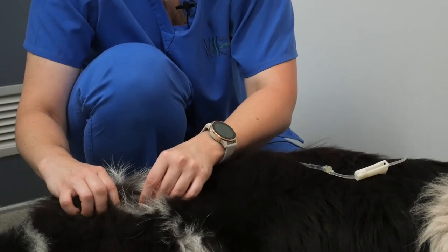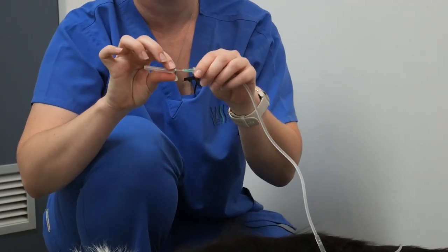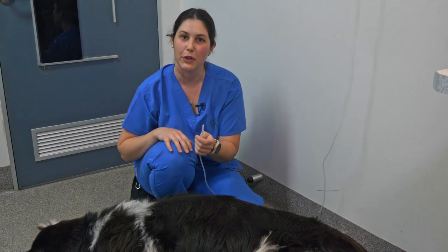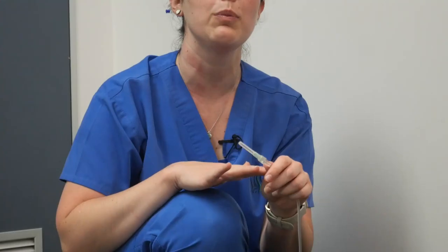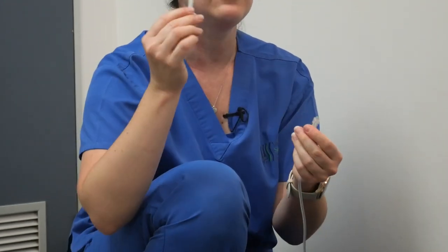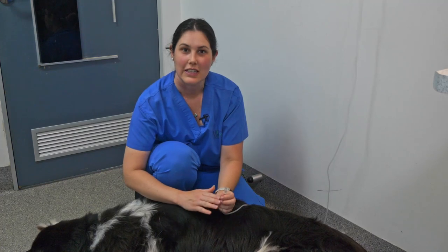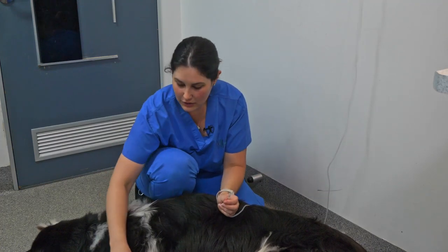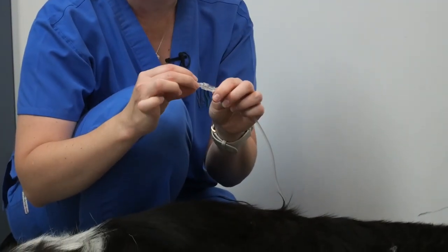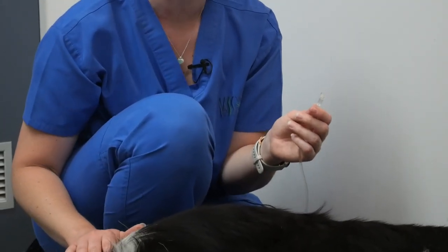Then pull the needle out nice and cleanly, just like that, and replace the cap so it's nice and secure. When you've finished, keep everything clean for next time. Pop the needle back into a container to take to your vet so it can be disposed of appropriately. To keep the line clean, replace the cap from the original packaging — somewhere you've kept clean and dry — and it's ready for storage for the next time you need to give subcutaneous fluids at home.